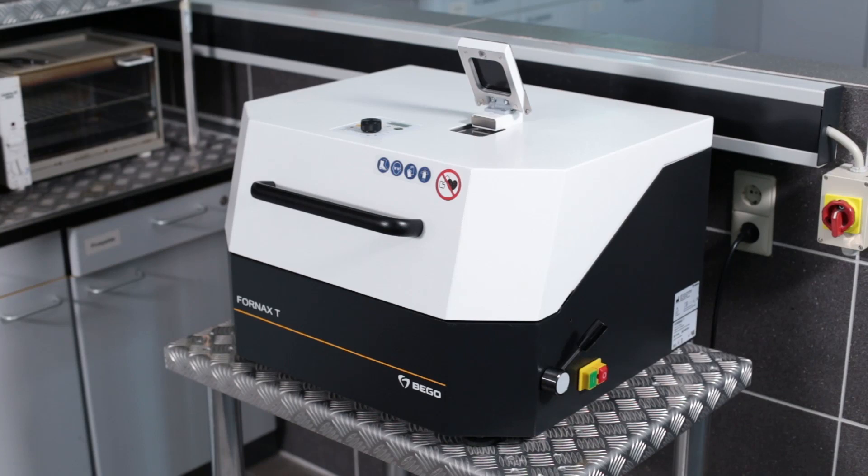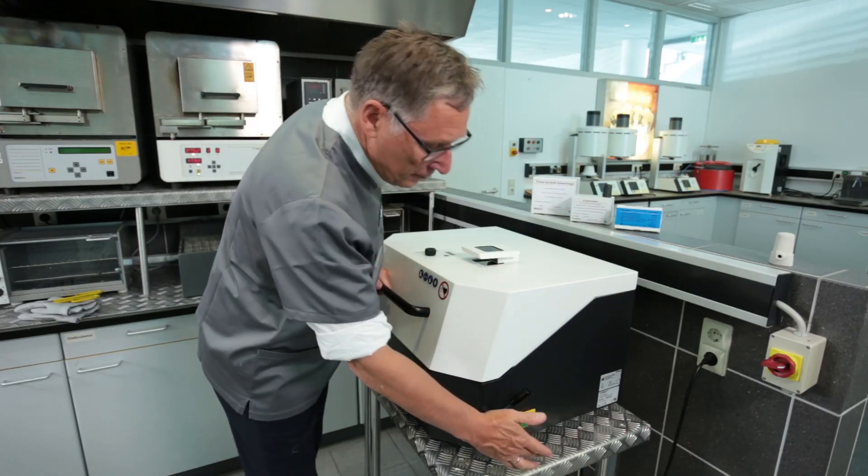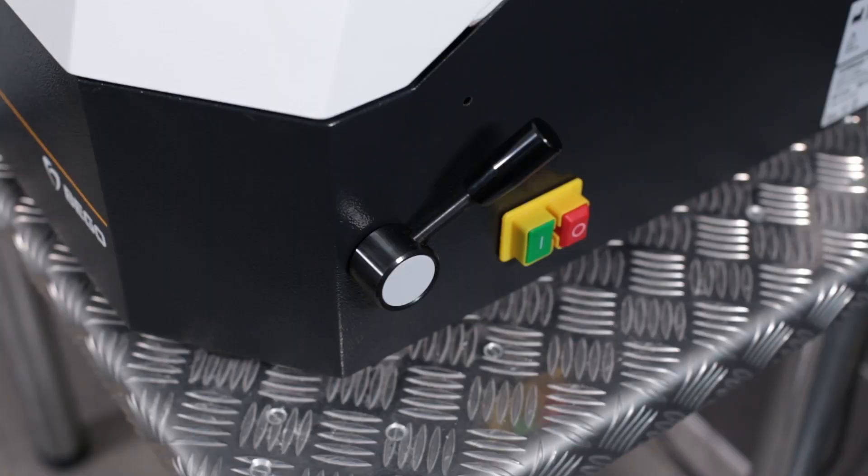First, switch on the Fornax T by pressing the green main switch on the right side of the machine. After a few moments, a sound indicates that the internal cooling system has been activated.